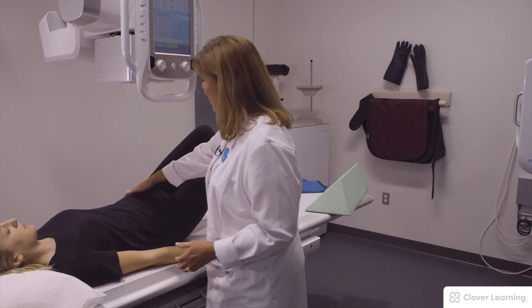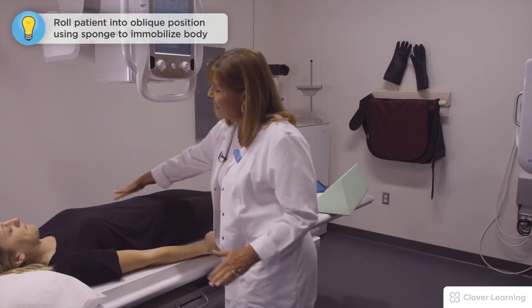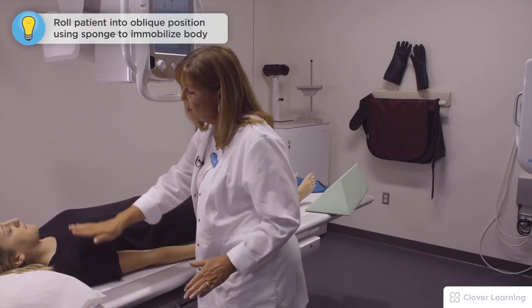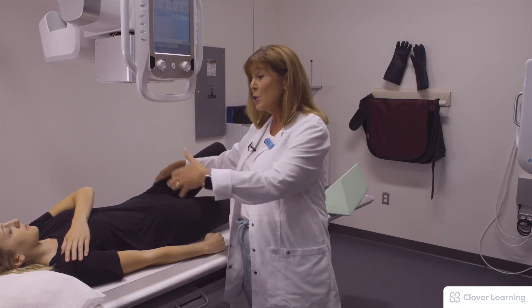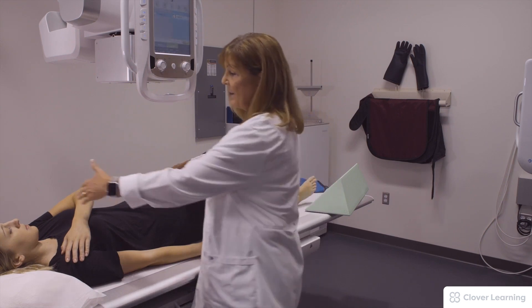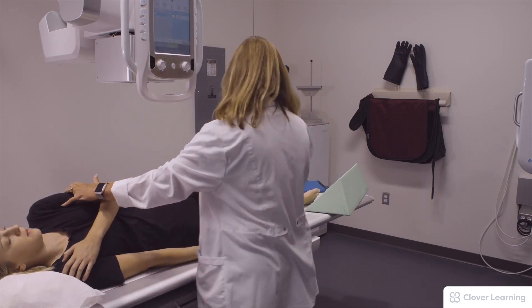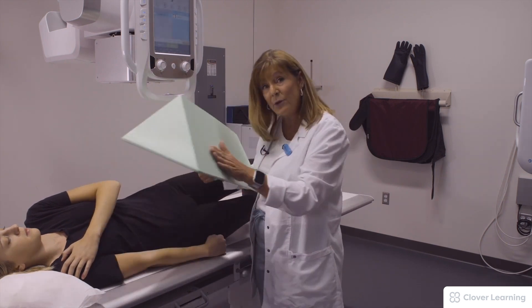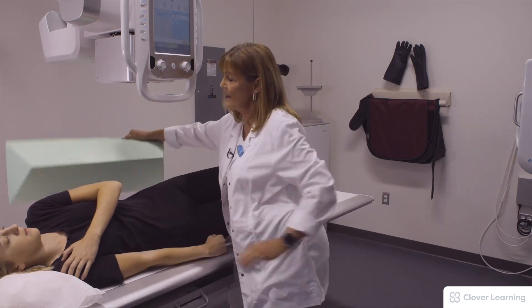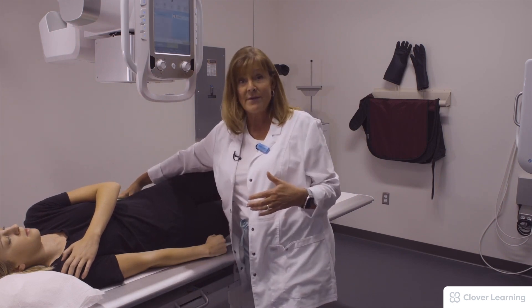I'm going to have her stretch her legs out, take this hand and touch over here on this shoulder, and bend this knee. I'm going to control her movement so that she rolls uniformly — taking her shoulder and her hip and rolling her like a log up 45 degrees. I'm going to use a 45 degree angle sponge to help immobilize the patient and ensure I'm at 45 degrees.